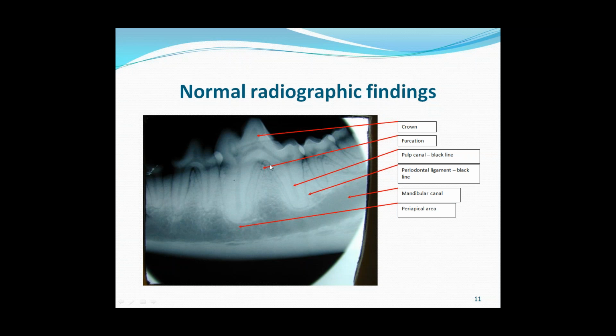So that's the first item that I look for to see whether the bone around the tooth is healthy. You can also notice that the bone around the apex, or the periapical area of the roots here, see by the lowest arrow on the mesial root, is quite continuous and consistent, and there's no voids in the bone as well. So that's a healthy picture of a bone.